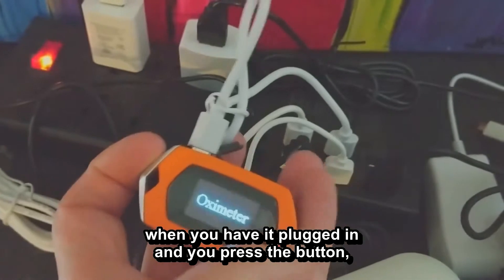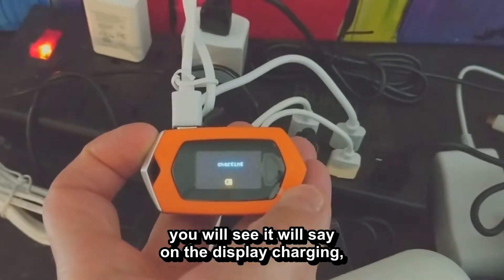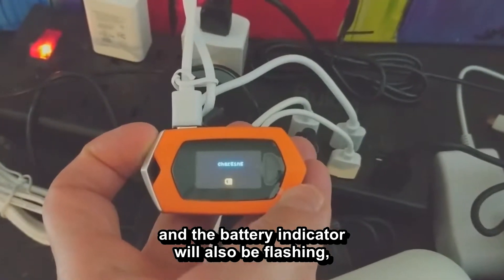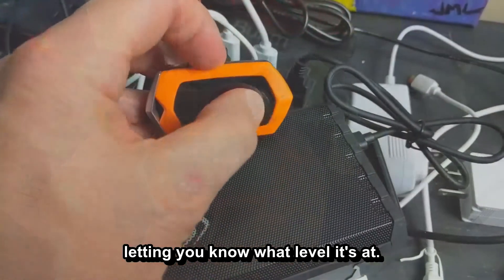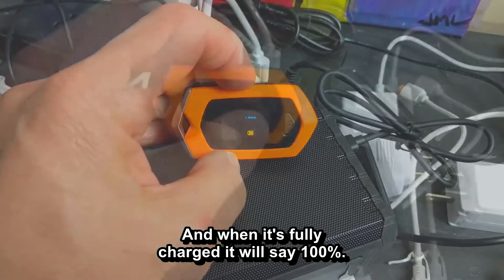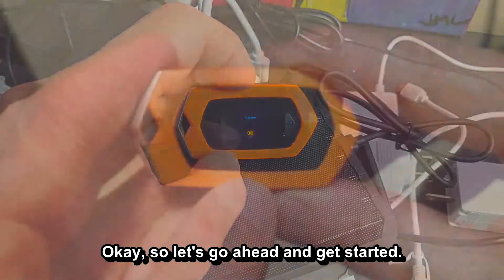When it comes to charging: when you have it plugged in and you press the button, it will say on the display 'charging.' The battery indicator will also be flashing, letting you know what level it's at. And when it's fully charged, it will say 100 percent.